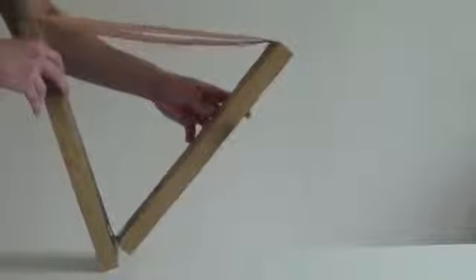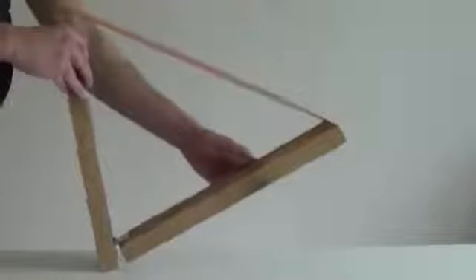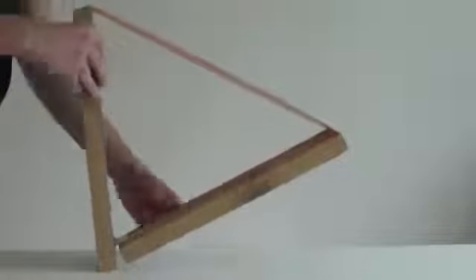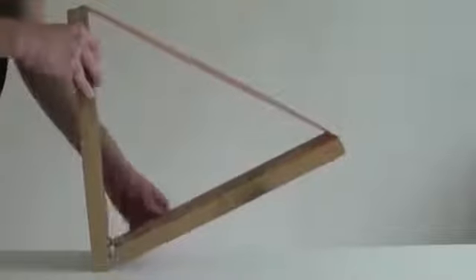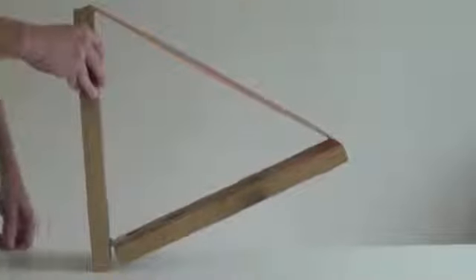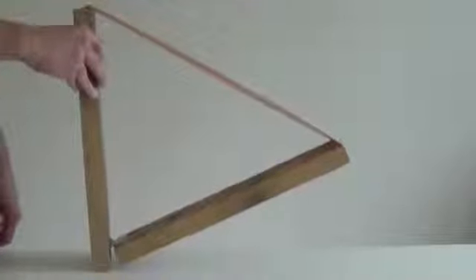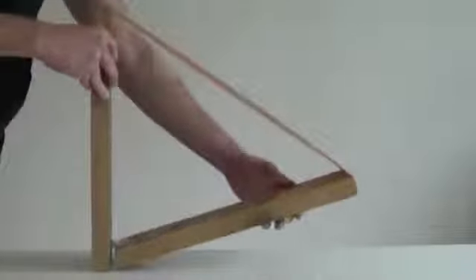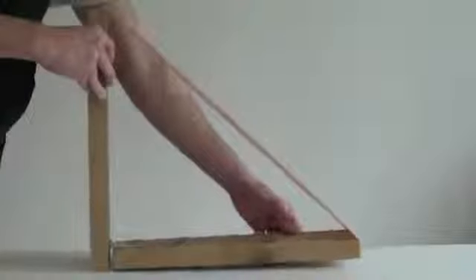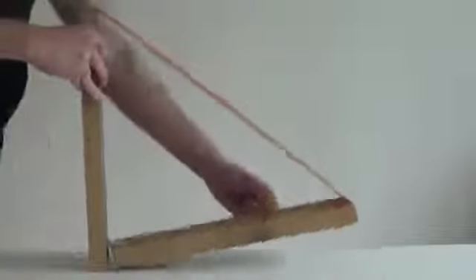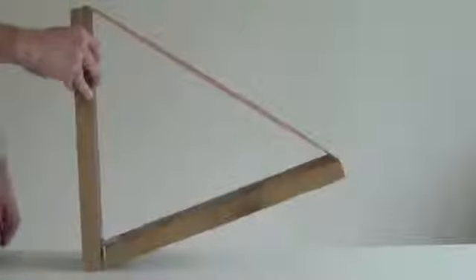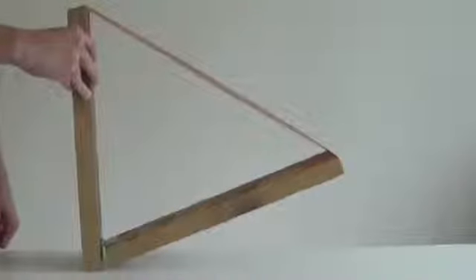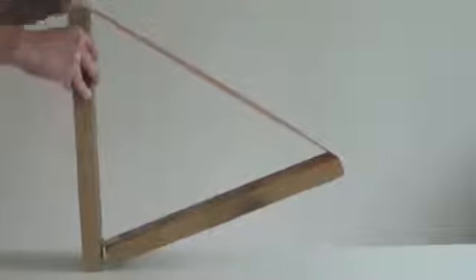You will have observed in the last example that we applied the tape basically with the body part in the short position. In this case, we've applied it with the body part more in a lengthened position. We have put some stretch on it so there is some elastic effect. But even in this position, if we stretch it all the way into the outer range, the elastic recoil or that mechanical effect is diminished when we compare it with the initial example.